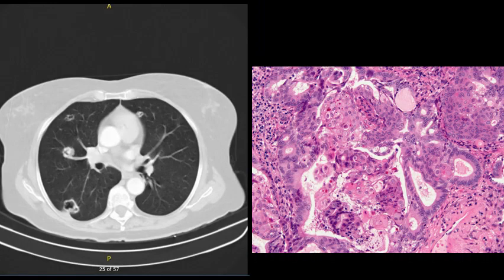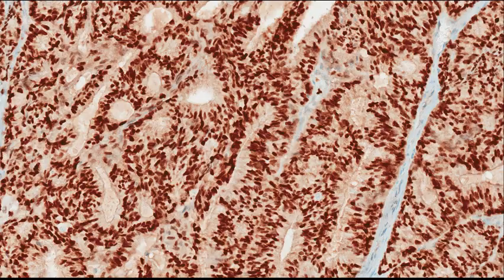Here's an example of an endometrial cancer that metastasized to the lungs, producing multiple cavitary bilateral nodules — actually after a long disease-free interval. On the right side you see the endometrial adenocarcinoma with a cribriform pattern and some squamous differentiation, and here's the PAX-8 stain showing strong and diffuse nuclear positivity in the metastatic tumor cells.